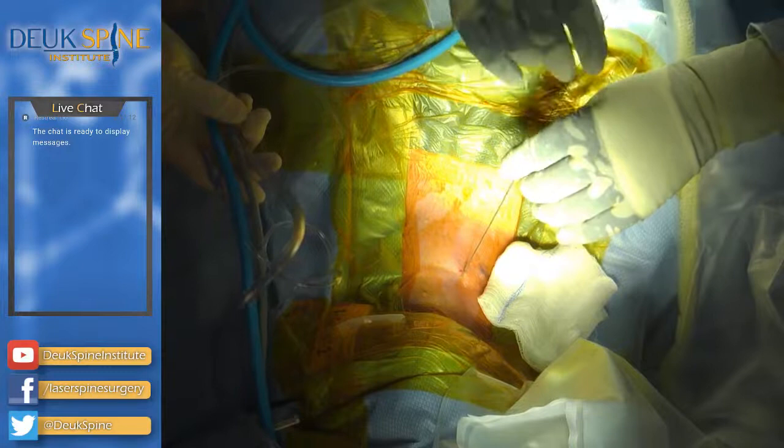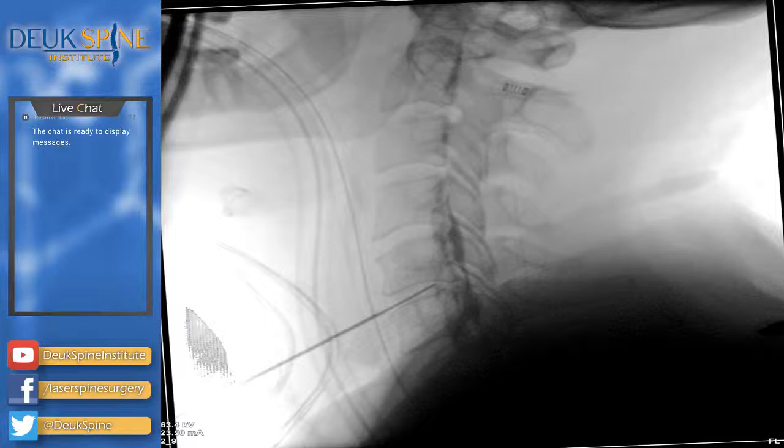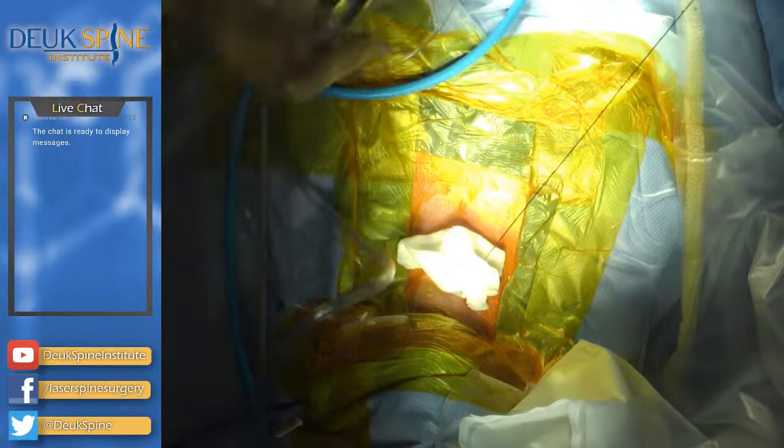I'm now removing the needle and I'm leaving the guide wire. Guide wires are quite an interesting concept. Basically, you access the part of the spine that needs to be operated on using a tool that allows you to orient and navigate directionally. And that tool here is the needle.